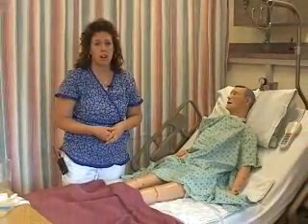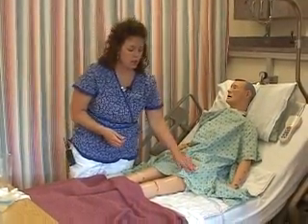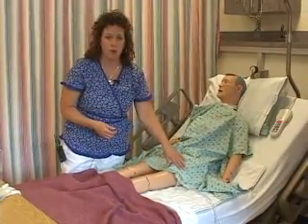What I'm going to show you now is how to take care of your catheter so that you do not cause any trauma to yourself and cause any complications. First of all, it's very important to remember with any drainage bag that you're using that you use the leg straps that are provided with the catheter drainage bag. This helps allow slack for the catheter and helps prevent pulling.